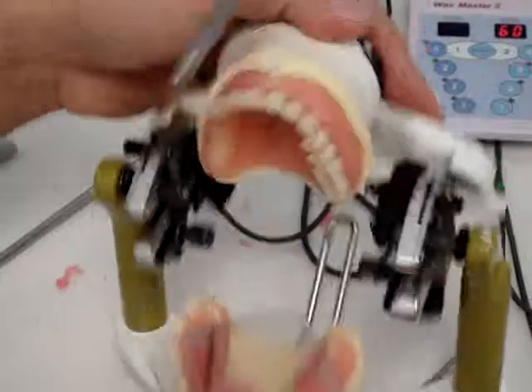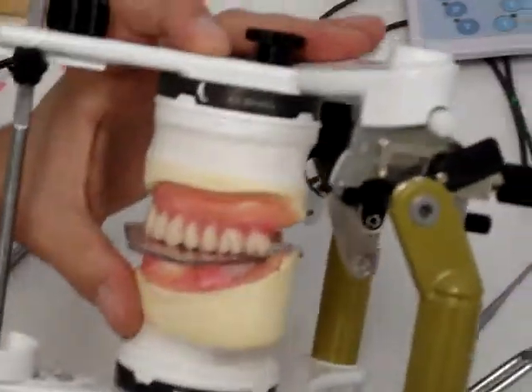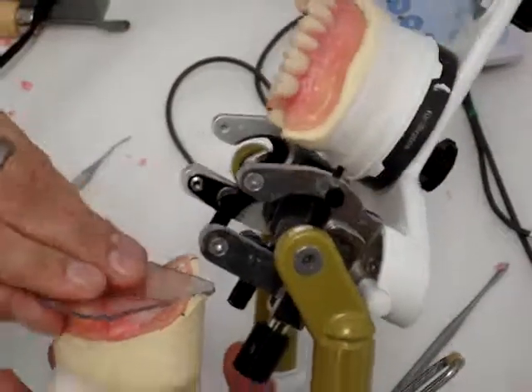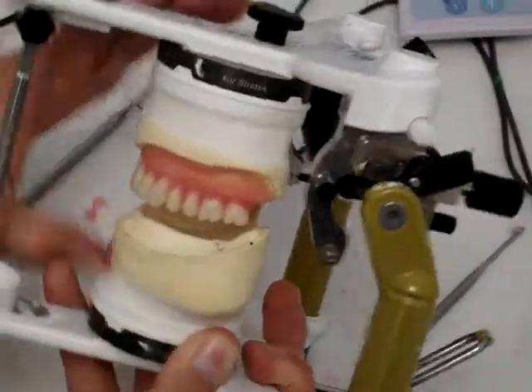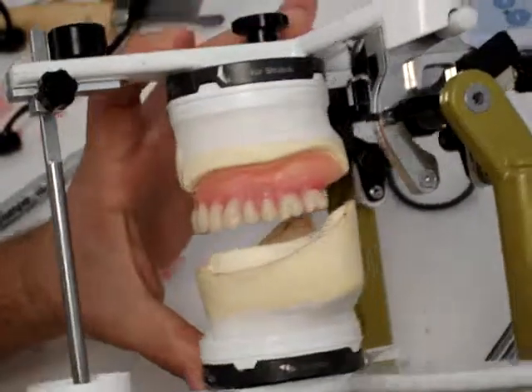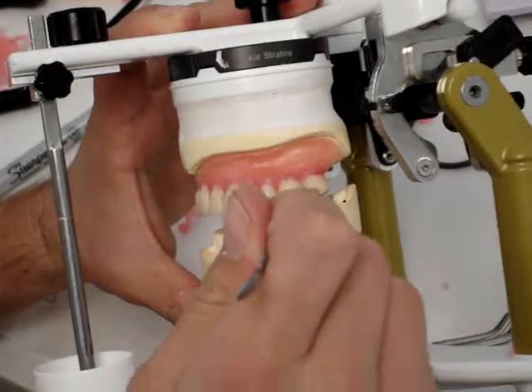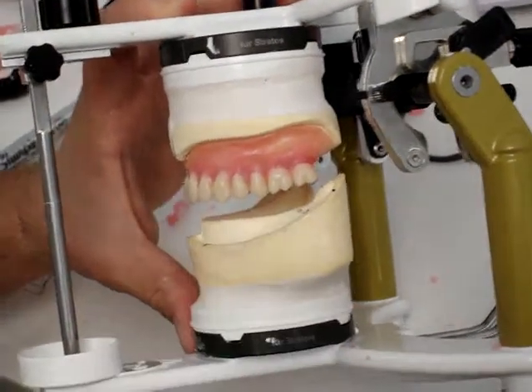And you want to make sure that when you look at it from the side, you see a nice, even curve of Spee. It's supposed to follow basically this curvature. So your curve of Spee here should follow this nice gentle curve of the mandibular arch.